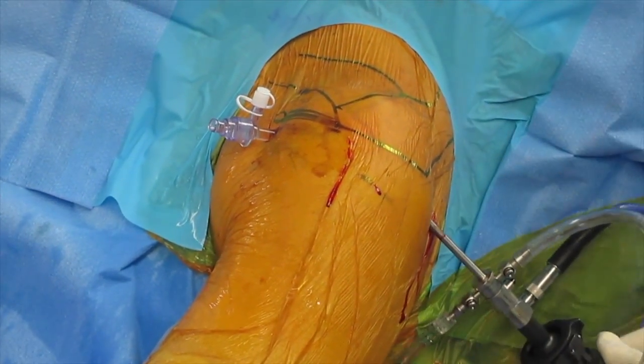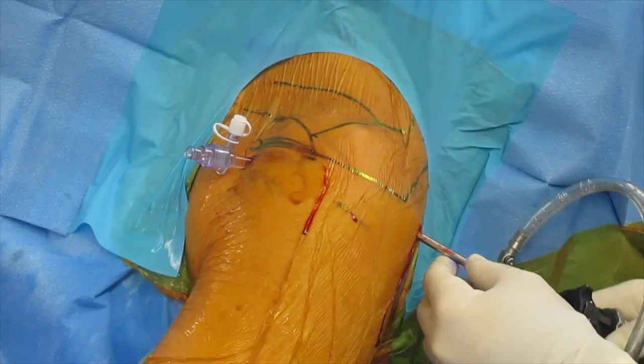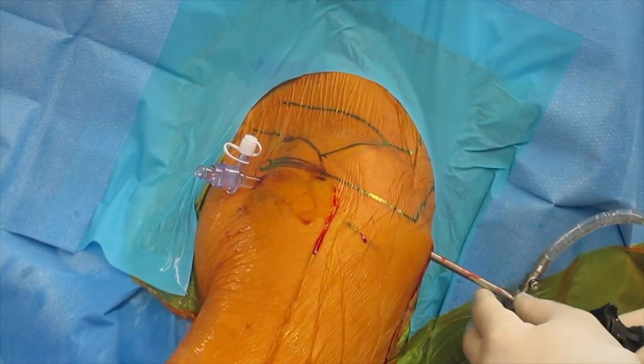The surgeon can then make medial to lateral movements with the tip of the trocar to confirm that the arthroscope is in the subacromial space and not the glenohumeral joint, although these should be limited as they can stir up bleeding.